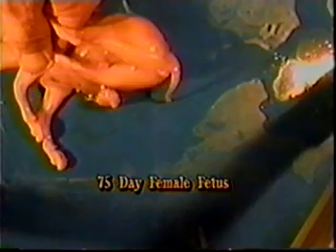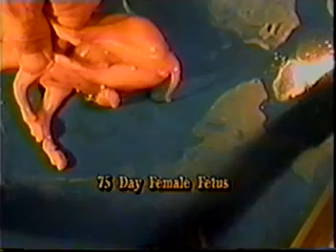This actual female fetus is positioned like the previous ultrasound frozen image. The yellow highlighted area represents the female GT.